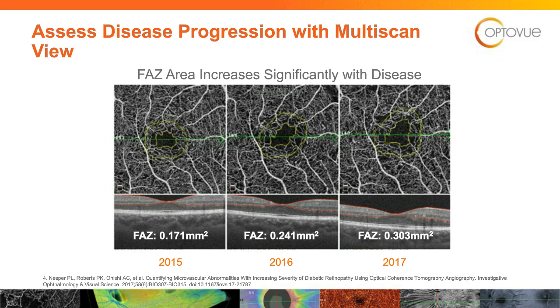And then remember that ocular surface. Again, if you're having any issues, put a drop of artificial tears in to refresh that surface, and that will help with some scan acquisition along with fixation. Give the patient breaks if they need to, but most often they don't. And just remember that surface and that media when acquiring those images.